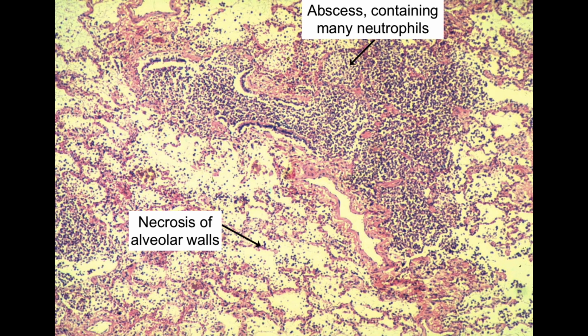We can observe alveoli containing edema, fluid, and inflammatory cell infiltrates, including many neutrophils. The alveolar walls will also appear congested, and in some sections you will be able to see both cellular and fibrinous exudate within the alveoli, as well as early organization of the exudate. In this specimen, we can also see focal tissue destruction and congested vessels.